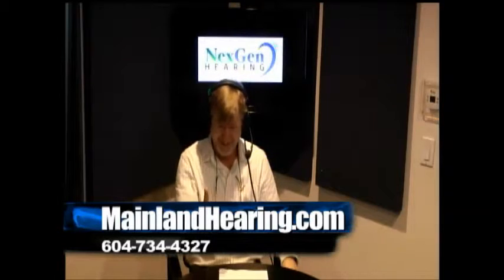Let's talk about the hearing test and what's involved, because I think some people might be afraid if it's got a doctor in front of it or some letters after the name. That means they're going to do stuff to me. Let's try to take some of the mystery out of going for the hearing test. Here's what we do. We're very polite. We say hello. We offer you a cup of coffee or a cup of tea. We talk to you about your hearing problems. It's called taking a case history.